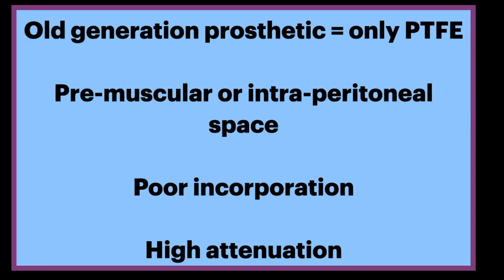Some patients operated on a long time ago may still have old generation prosthetic mesh made of only PTFE. They can be located in pre-muscular or intraperitoneal space. They are not really used anymore because of their poor incorporation inside the abdominal wall and limited commercial availability. They are well visible on CT due to their high attenuation value.